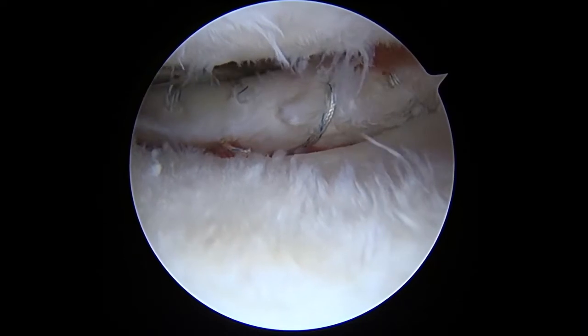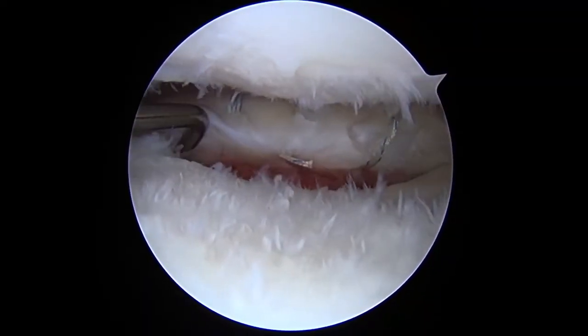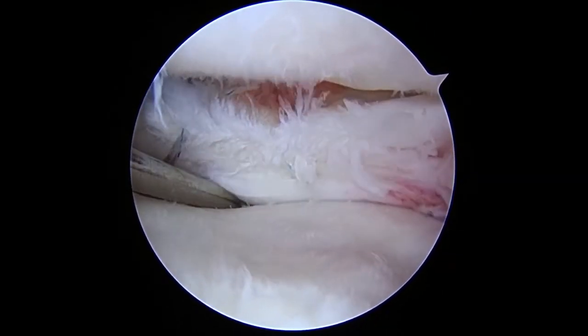The final arthroscopic examination shows the properly secured repair and the stabilized posterior LM by probing.